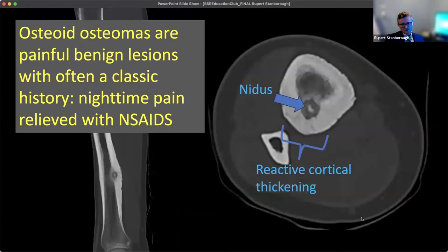The one statement I want you to know: osteoid osteomas are painful, benign lesions often with this classic history. The nidus is this lucent area, and there may be a calcification within it. When you do your treatment, you really want to cover that nidus completely.